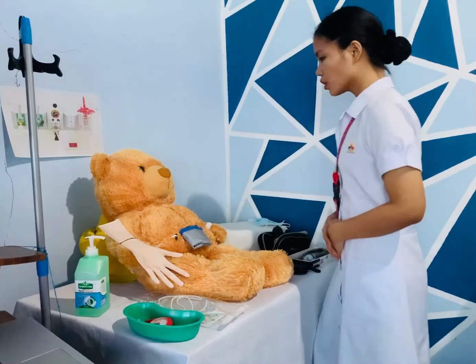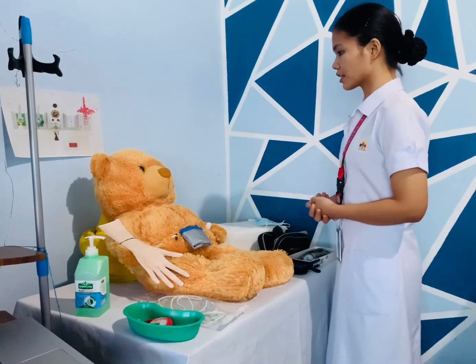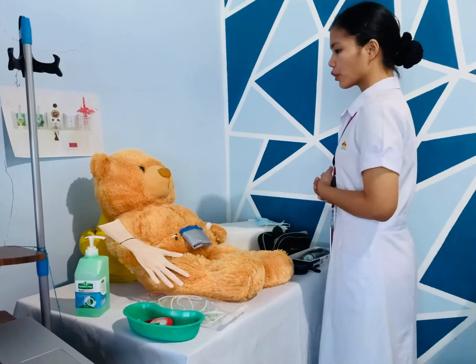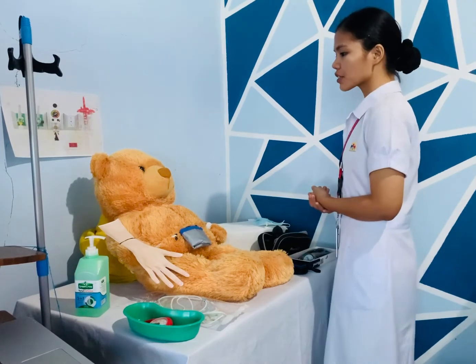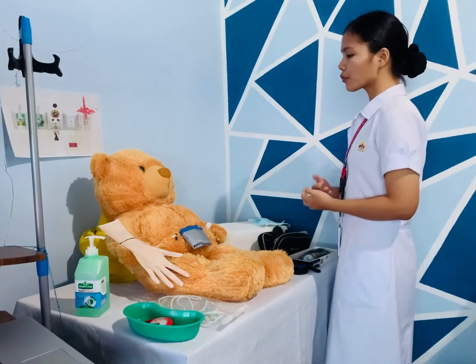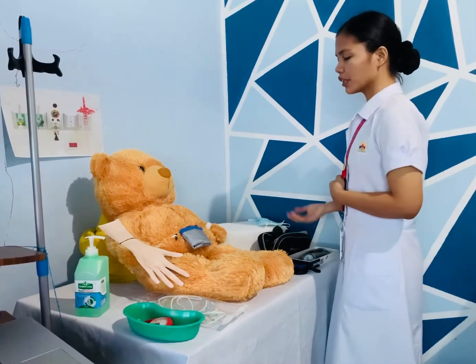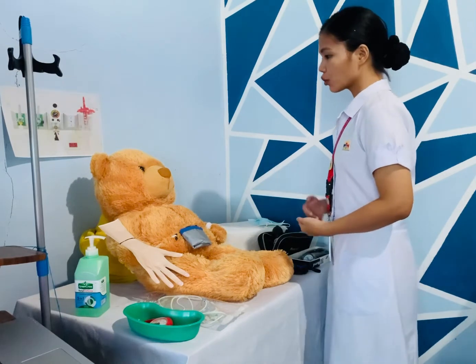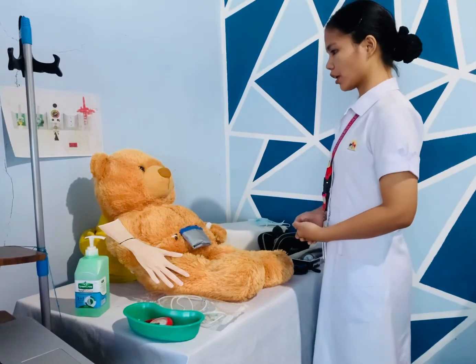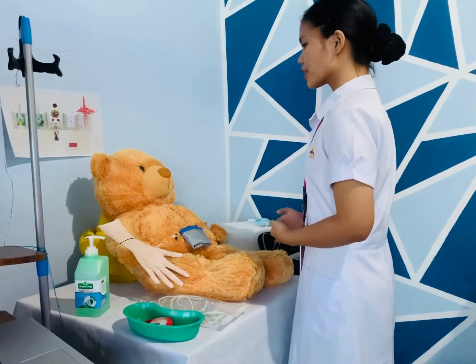Okay, ma'am, thank you. So now ma'am, I'm here to assess you for your peritoneal dialysis treatment, which will be ordered by your doctor. This treatment will help you to remove the waste products from your blood and it can also help your kidney. So, after ko pong maituro sa inyo yung mga procedure, pwede nyo na pong gawin yung treatment na ito to yourself sa bahay ninyo or sa workman at kapag magtra-travel po kayo. So, I need your cooperation po during this procedure. Is that okay with you, ma'am?